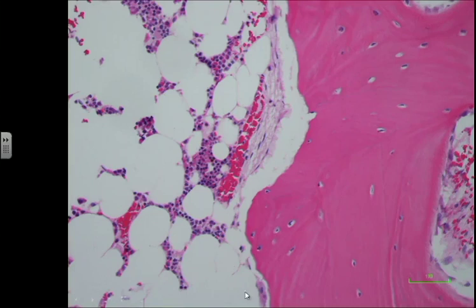Then the other question on the same picture, these white globules, what do we call them? What do they represent? The third question is these cells intermixed with the white globules, these small purple cells, but a lot of them, what do they represent?